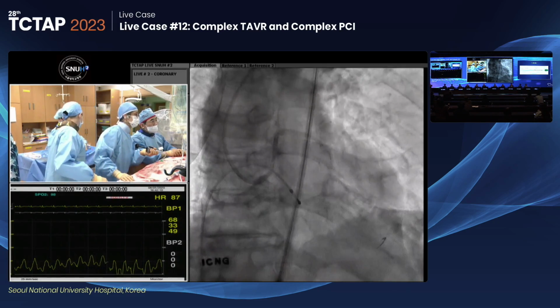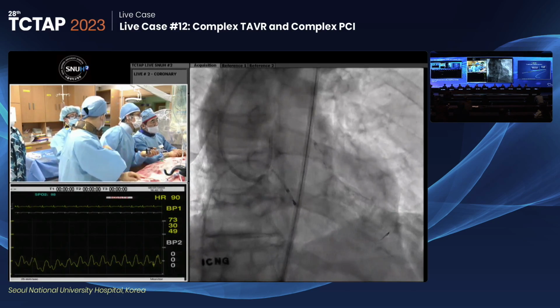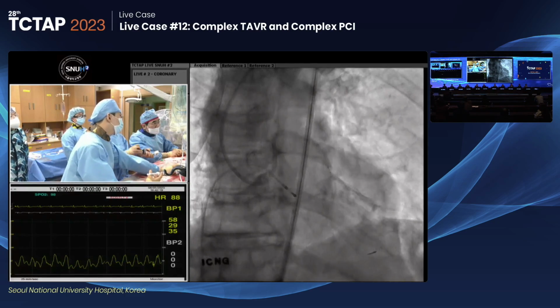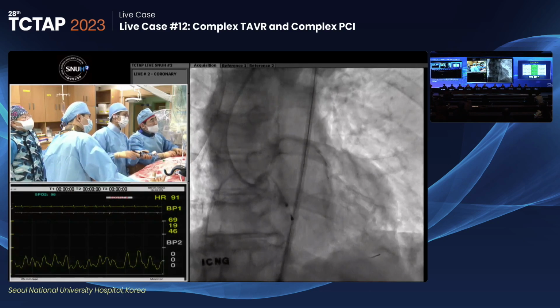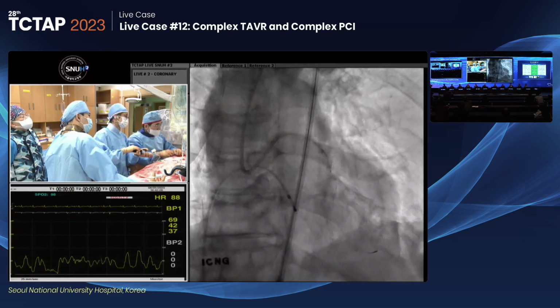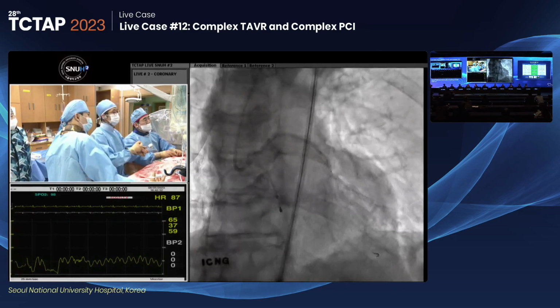Where is it now? Okay, this is 1.0. Still not good. Doesn't go anymore. Inflation. Okay. This is a 1 millimeter. 1.0. Yeah, 1 millimeter. You know, as the last resort, if you can try, do like this.